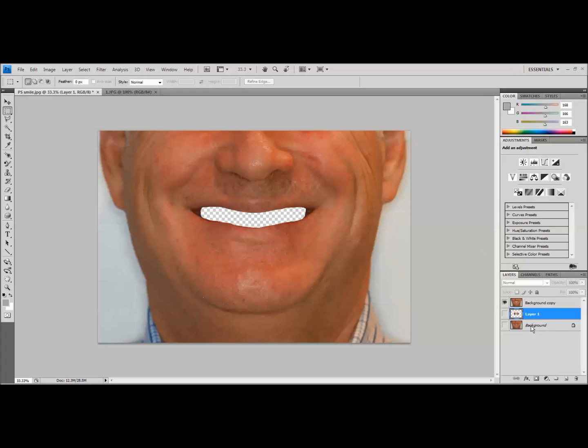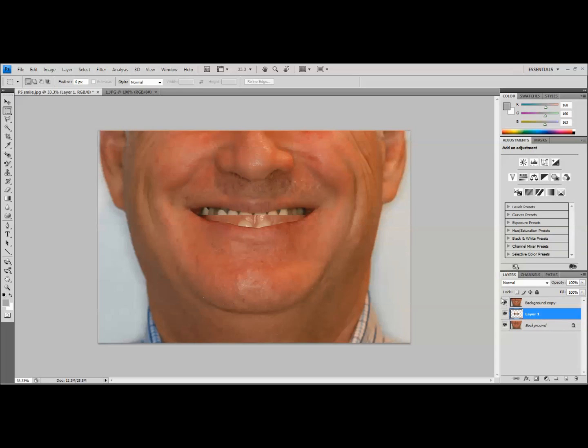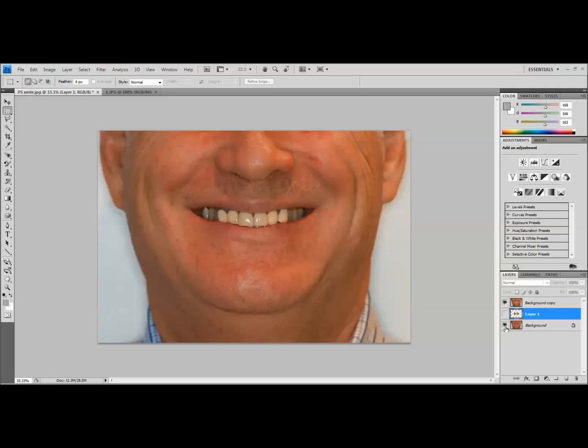Okay, so if we look at our layers here on the bottom right, we've got three layers. Currently we've got on the very bottom, the patient's original picture. In the middle, we've got the teeth that we just cut out from our idealized smile. And then on the top, you're going to have the patient's mouth cut out. If I turn off the other layers, you can see here. And so hopefully you get the idea is that we're going to sandwich in between these two layers the idealized teeth so that we can see what they would look like.